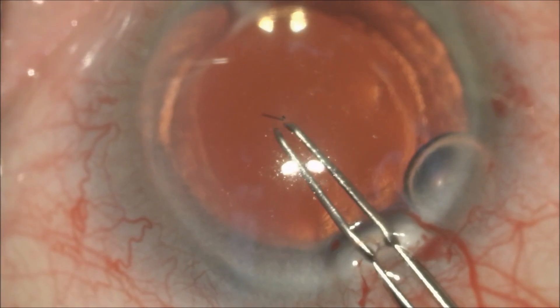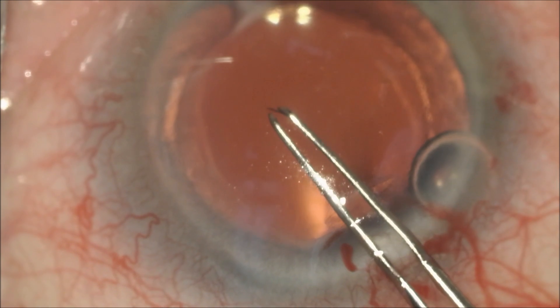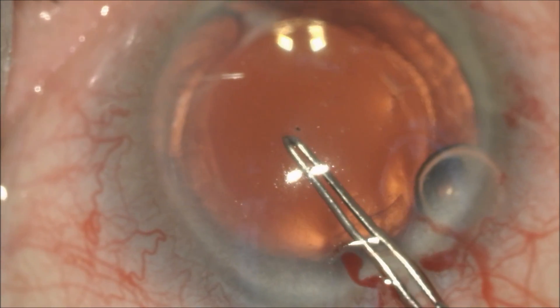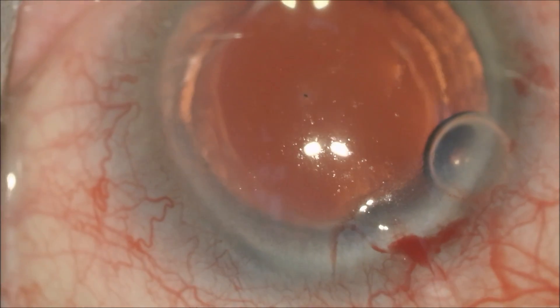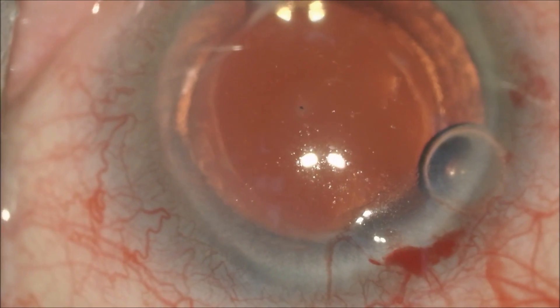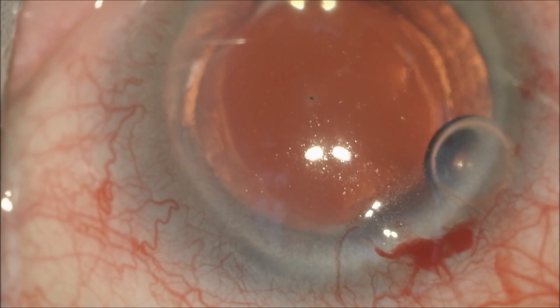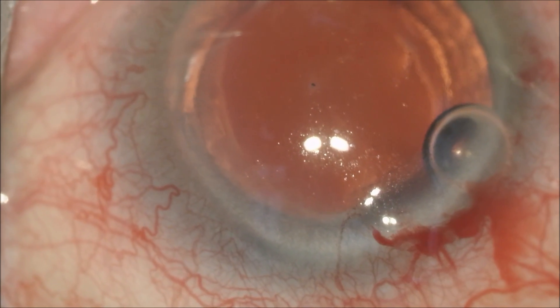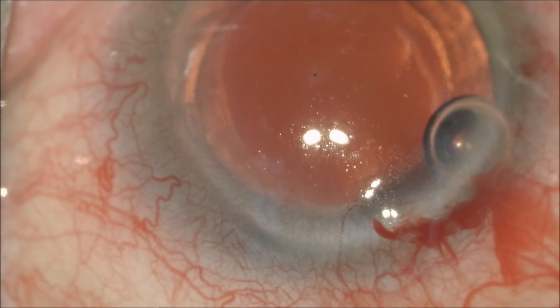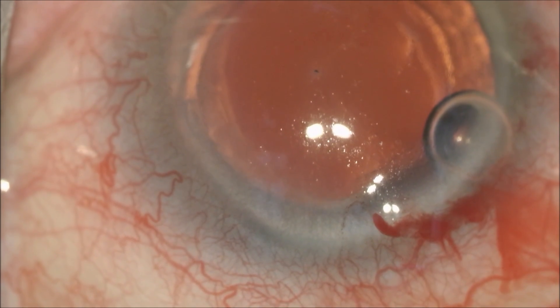We're going to now use a pair of capsulorrhexis forceps to grab the bee stinger. We get it here on the second grab and pull it into the eye and then out through the wound. There is a small portion where the barb of the bee stinger is left in the cornea, as it is impossible to remove through the inside of the eye without damaging the delicate corneal endothelium.